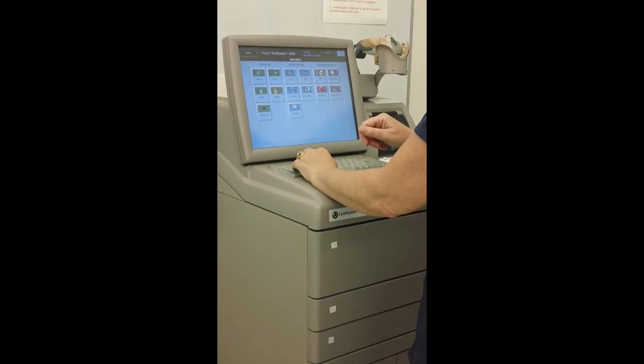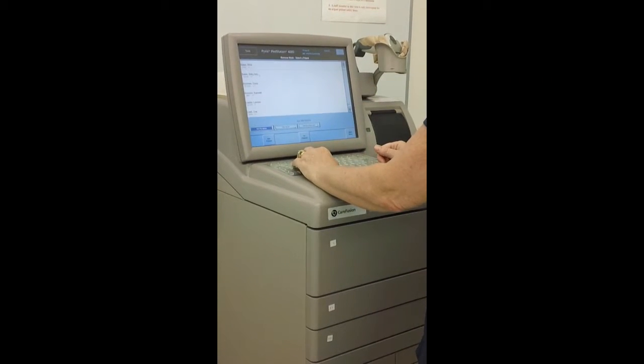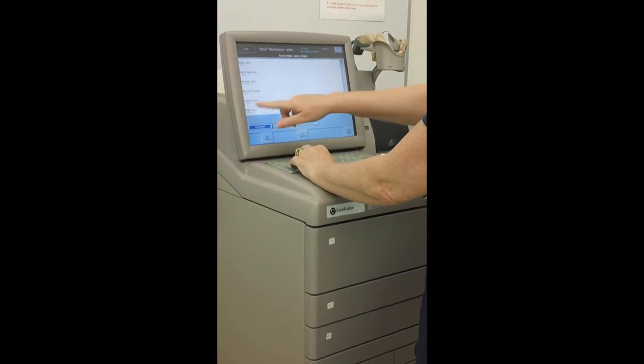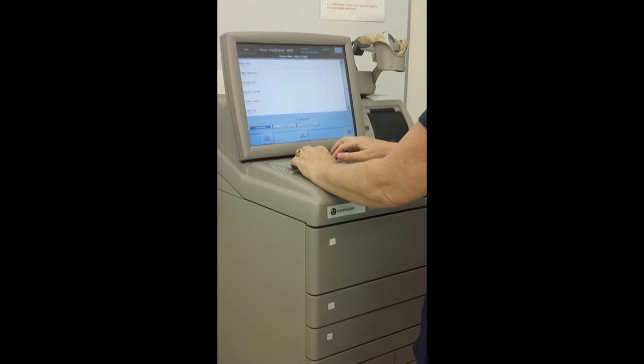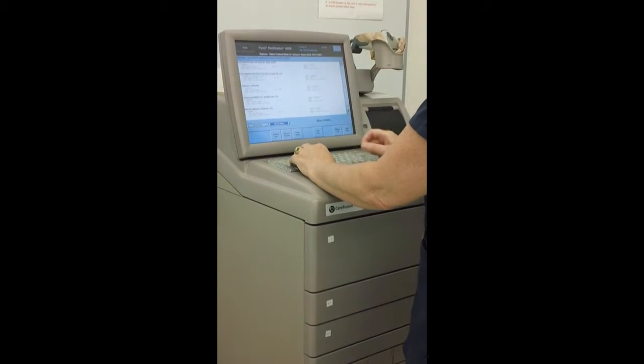So now I've got the main menu up. I'm going to do remove. And now I need to select my patient's name. Now my patient's name is Derek Johnson. So I've got B's and C's here. So I'm going to push the J key to make it go to where I can get Derek Johnson. I'm going to select him.